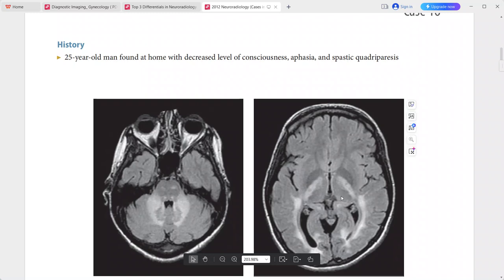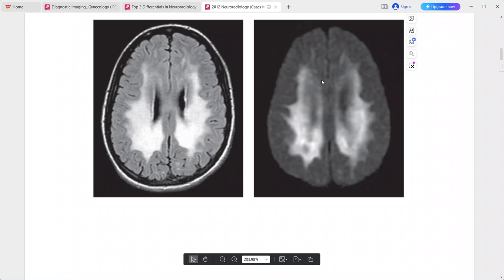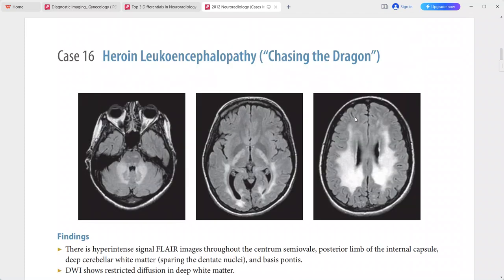Hyperintense signal is seen throughout the centrum semiovale, posterior limb of the internal capsule, and deep cerebellar white matter, sparing the dentate nuclei, and basis pontis. DWI shows restricted diffusion in the deep white matter. This is a case of heroin leukoencephalopathy, also called 'chasing the dragon.' Differentials include hypoxic-ischemic encephalopathy and other toxic-metabolic leukoencephalopathies.